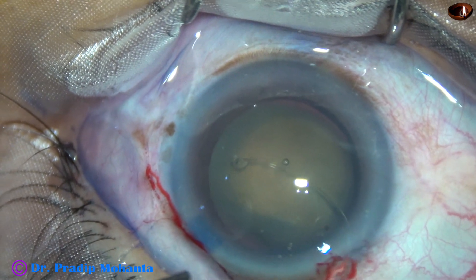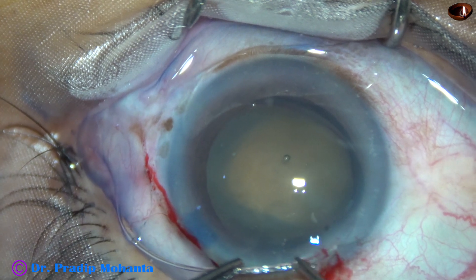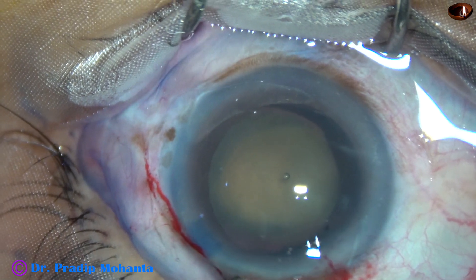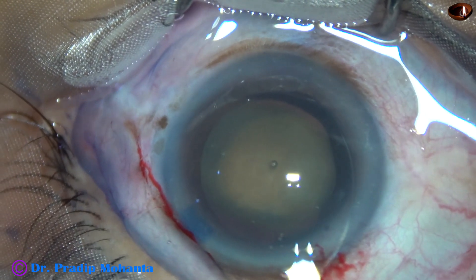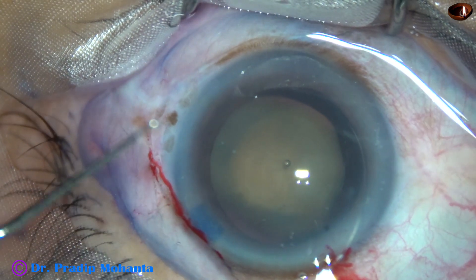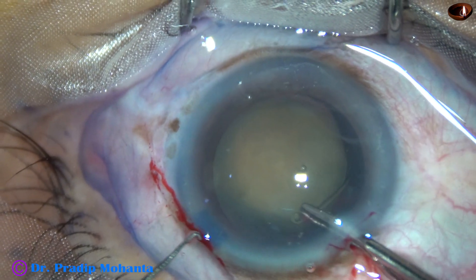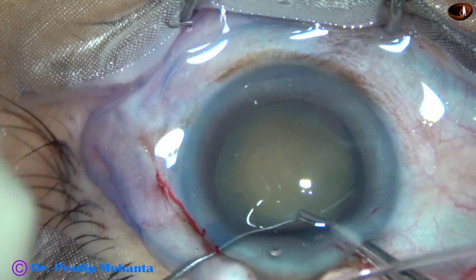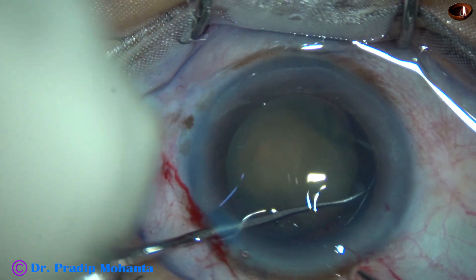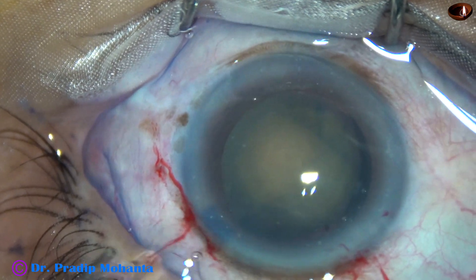And now I am implanting a capsular tension ring. I didn't take any chance in this case. The capsular tension ring is going to the equator. Here, since there is no cortex in this case, this CTR will not cause any hindrance in cortical aspiration, because there is no cortex. And now the CTR goes in the bag and takes its shelter at the equator of the capsular bag.